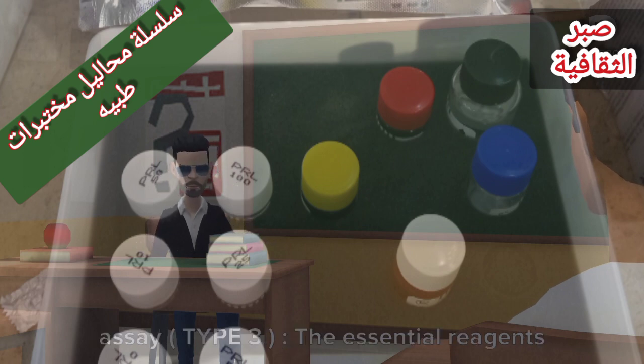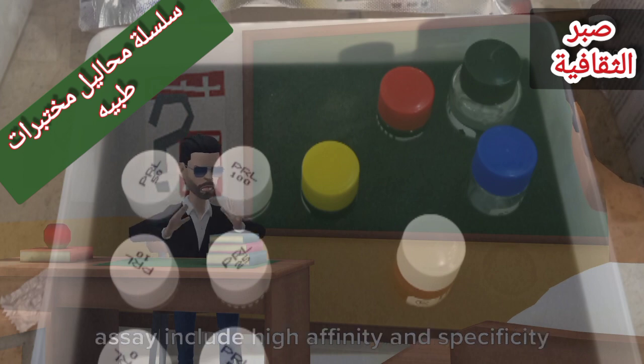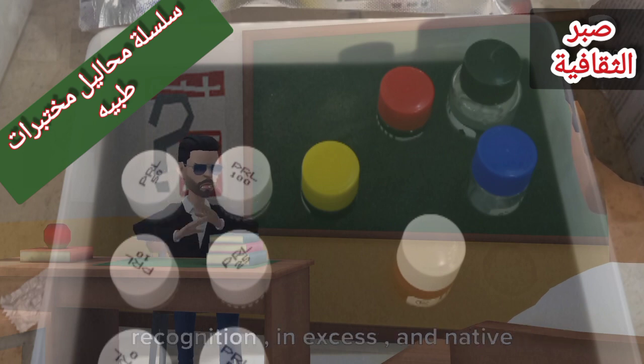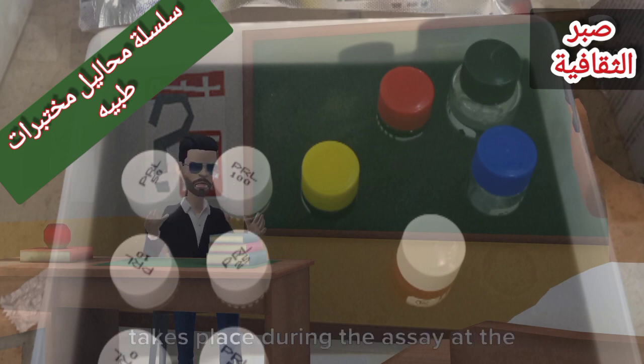3.0 Principle: Immunoenzymometric Assay, Type 3. The essential reagents required for an immunoenzymometric assay include high-affinity and specificity antibodies, enzyme-labeled and immobilized, with different and distinct epitope recognition, in excess, and native antigen.